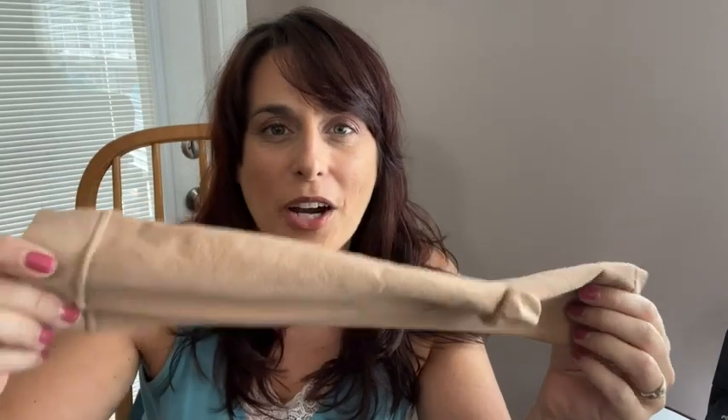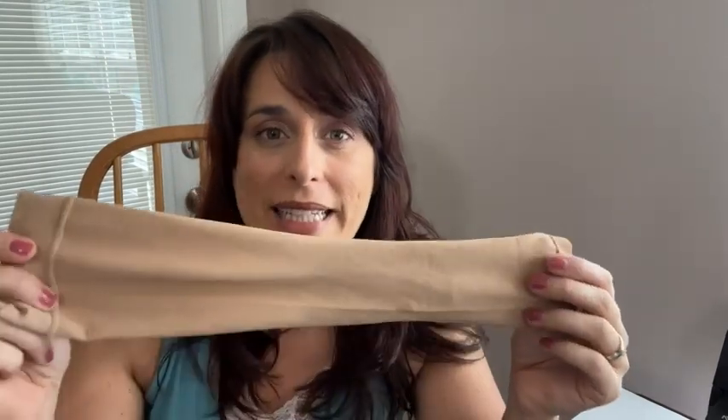Hey there, I'm Sarah with WTI and these are compression stockings that I have been wearing since after my ankle surgery. I needed to reduce swelling and fluid around my ankle, so that's why I've been using these compression stockings.